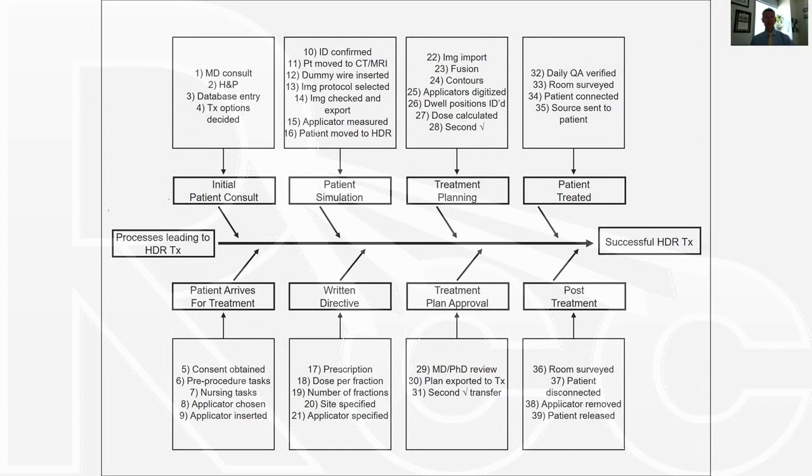So why is it important to look at a treatment procedure from a process viewpoint? The short answer is that it can help us to improve the safety in the clinic and for a patient. So it's really important when starting a program to think about the overall process and processes involved in each procedure, as well as the roles and responsibilities of the individuals involved with that patient's treatment. So this should lead to a critical analysis of the processes involved and areas that can lead to failure modes. So failure mode analysis can help to mitigate problems before they become actual clinical problems.